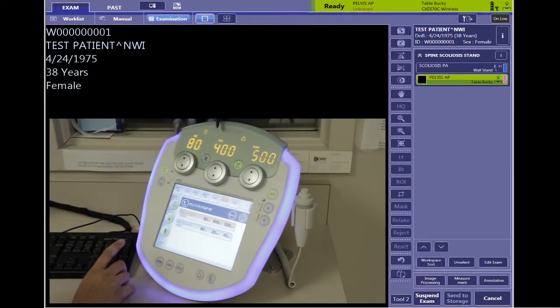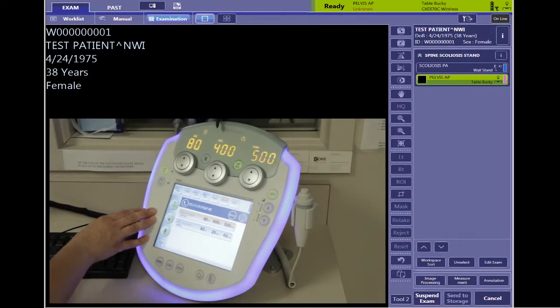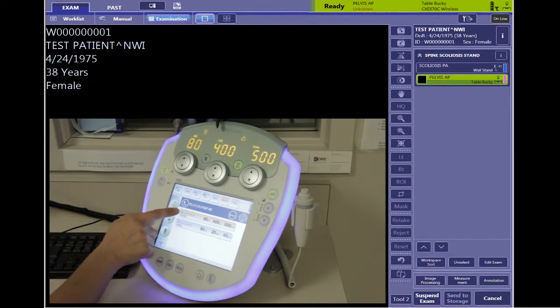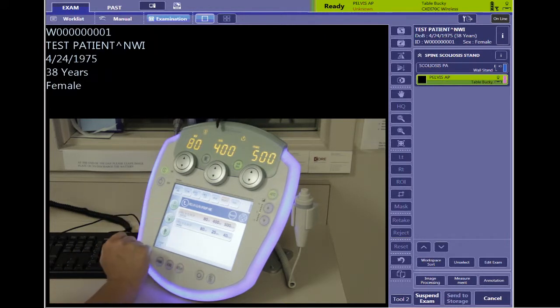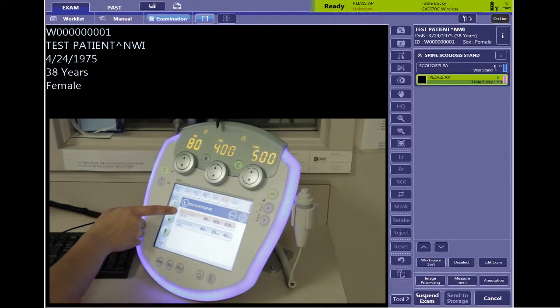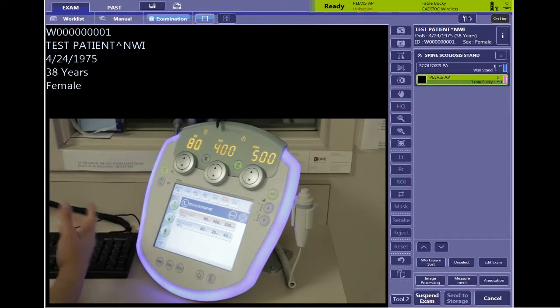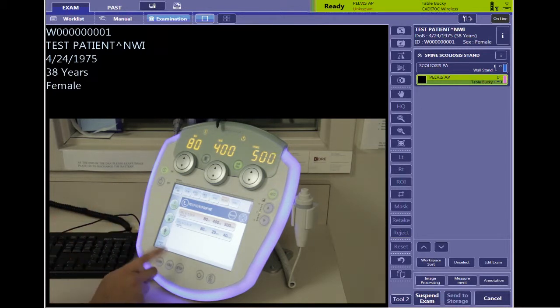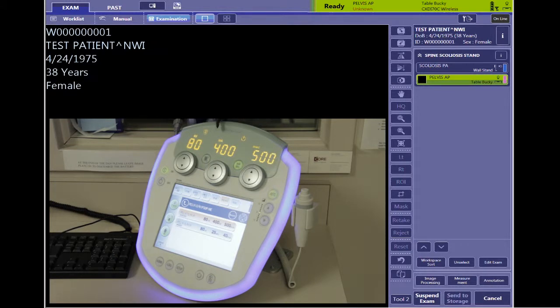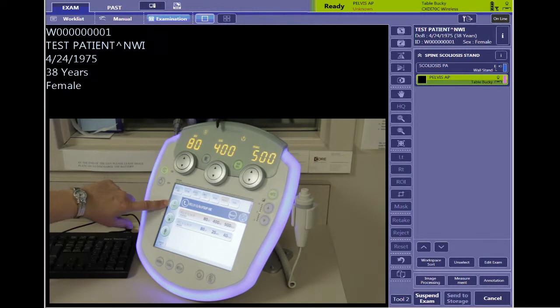On the generator panel, I have selected an AP pelvis or hip — it can be used for either. The protocol highlighted in orange is the one that is selected. If you don't want to use this one, maybe you want to switch to a manual technique. I typically have a manual technique right below, and you can select that just by touching the screen. The orange one is the one that is ready to be exposed.